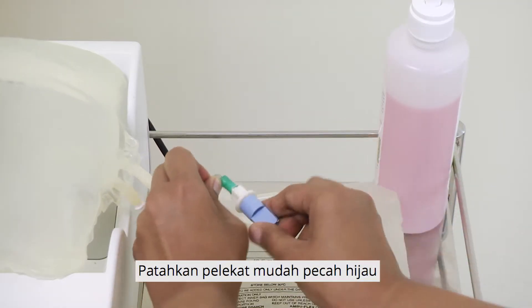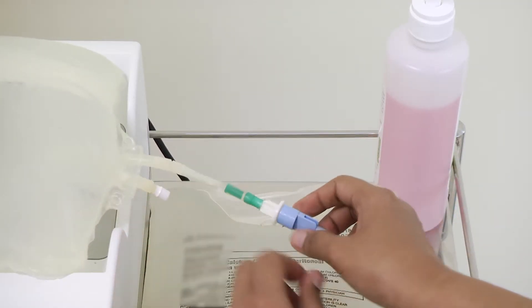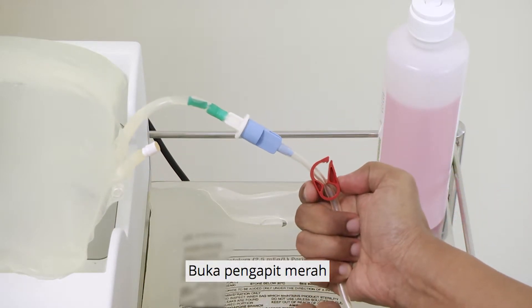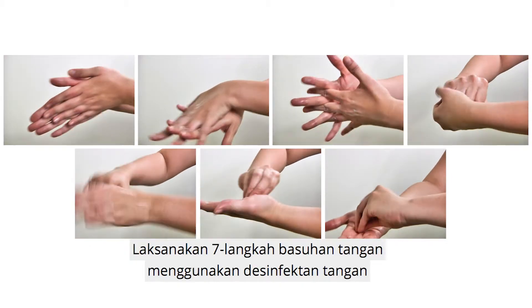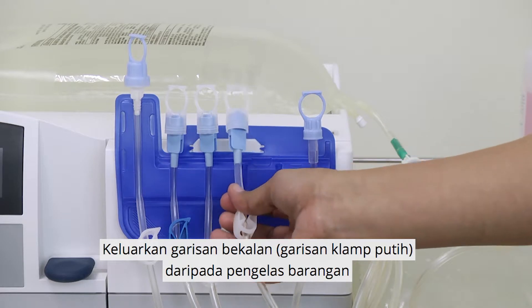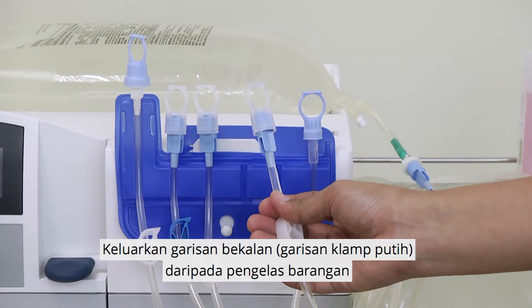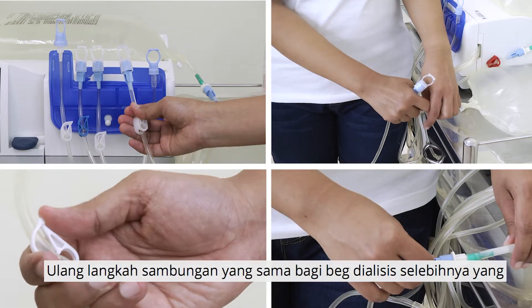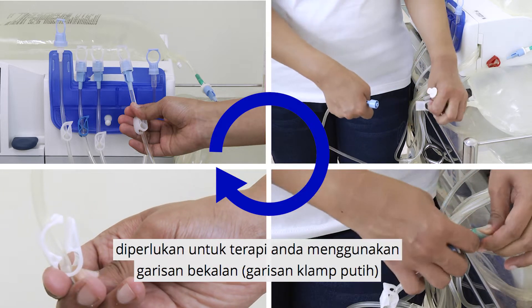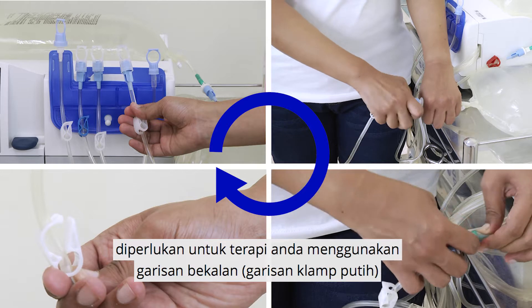Break the green frangible seal. Open the red clamp. Perform the 7-step hand rub using the hand disinfectant. Remove the supply line from the organizer. Repeat the same connection steps for the rest of the dialysis solutions needed for your therapy using the supply lines.